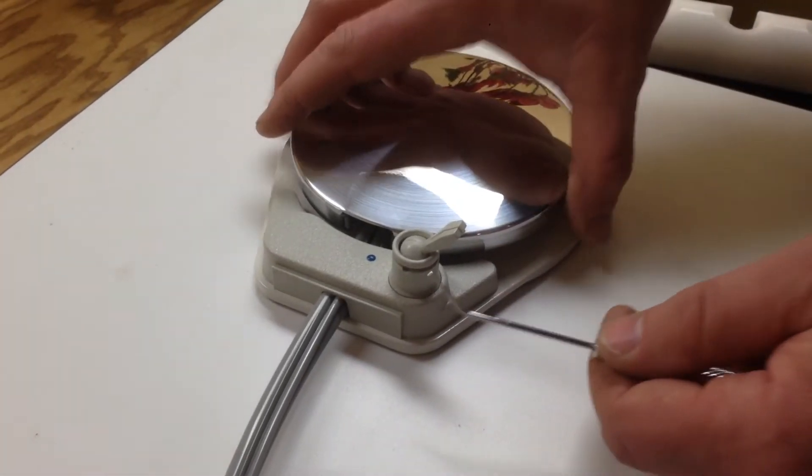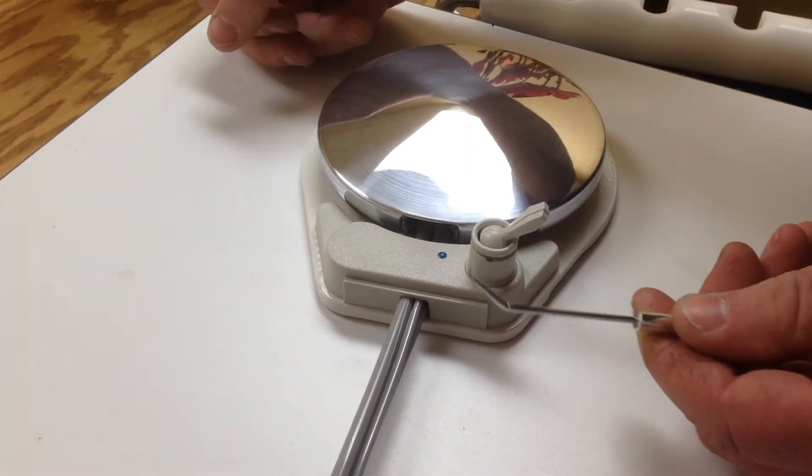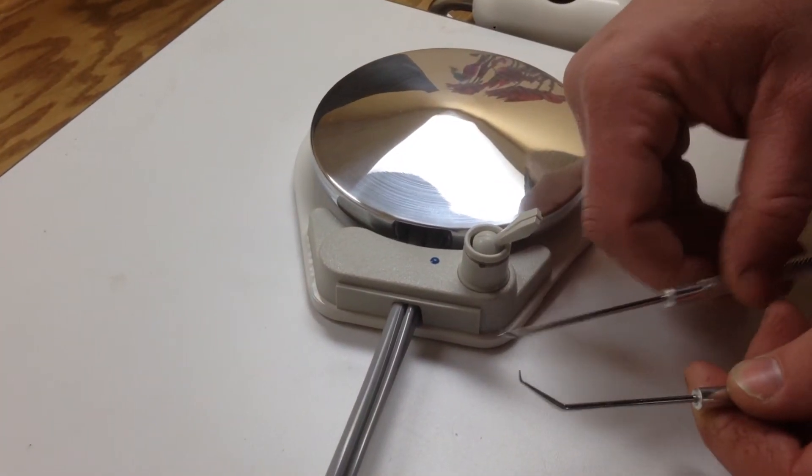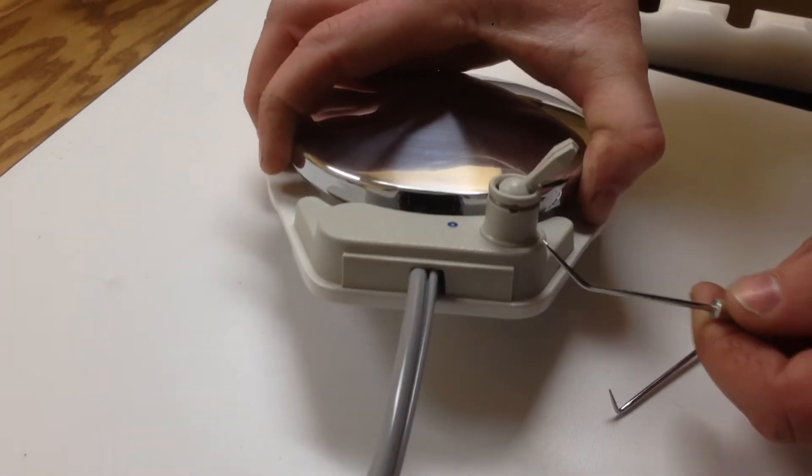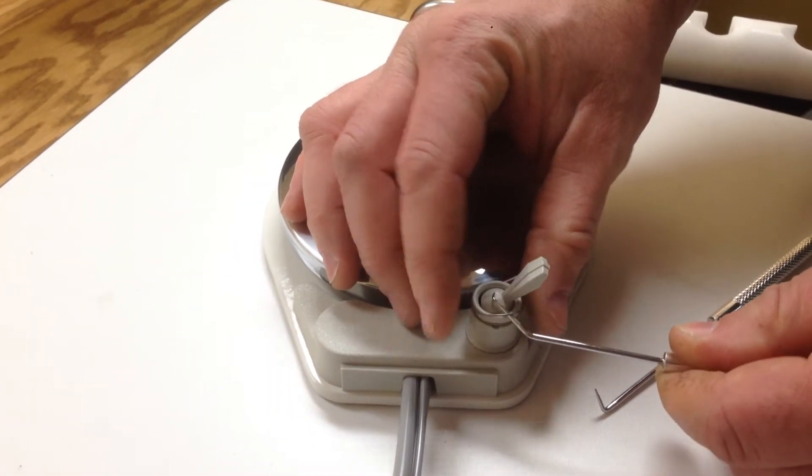Today we're going to change out this toggle in this foot control. Take an explorer or a pick of some sort. First thing we do is get in underneath this and pop it off like so.